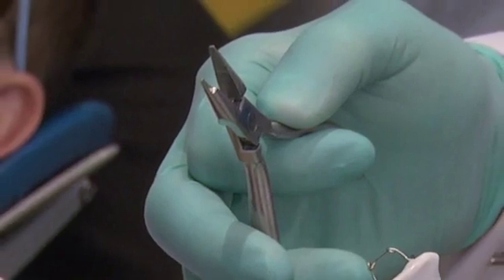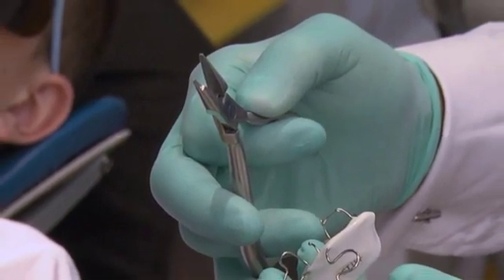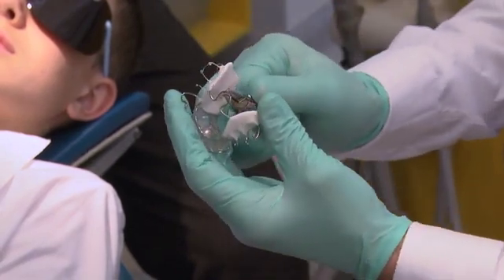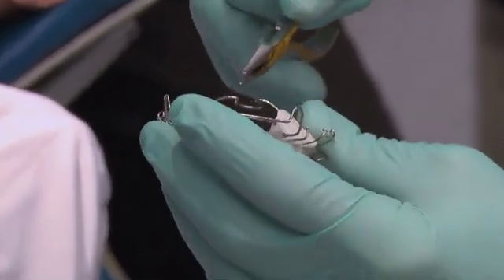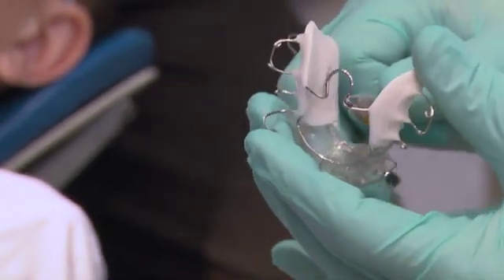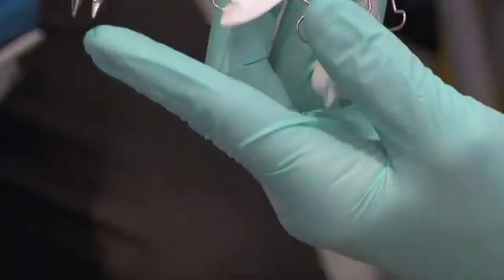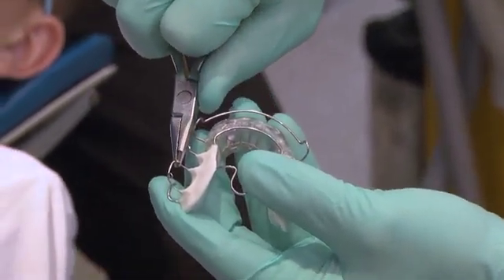For activation, if we talk about expansion: this is a standard universal Jarabac plier. For expansion, I press the omega loop, which gives me expansion. If I want to constrict the arch form, I activate the loop on the other side — three points of activation. As far as retention, the best way to tighten the clasp is to get the half-round plier, place it just before the loop, and activate it. That gives very good retention.